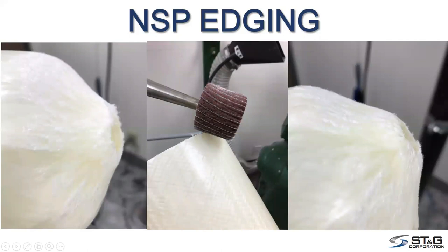So this is a good picture of that flapper wheel. It's a Tycro sanding wheel. There's some sandpaper with Tycro material in between. And I started with this fuzzy socket on the left, on the end. I finished it with this flapper wheel, and you can see it cut down a lot of the fuzz.